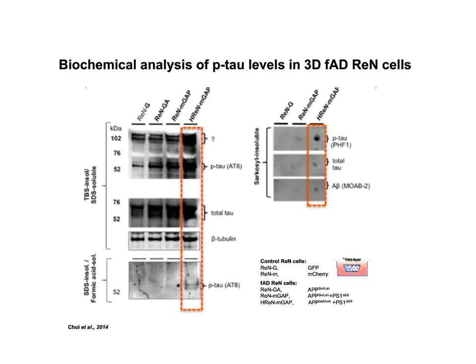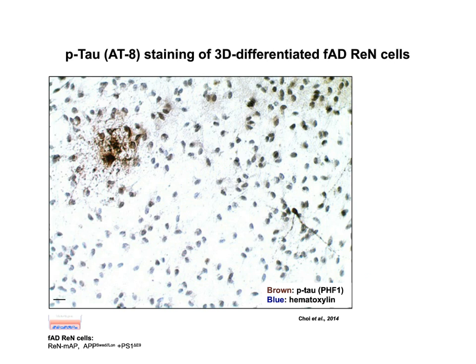And we did turn to the immunohistochemistry. As I explained before, hematoxylin is blue, the nuclei staining. And you can see this brown, which is the antibody against phospho-tau. And it's quite interesting because you can see individual neurons with a high level in the cell body and neurites, with very dystrophic neurite forms.